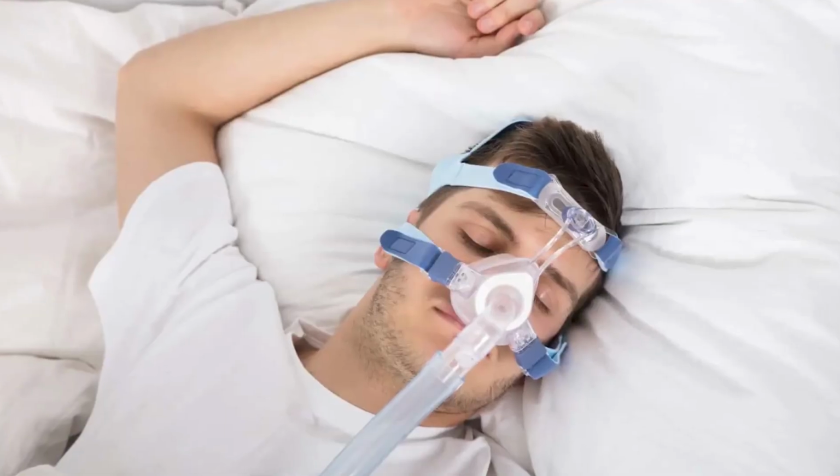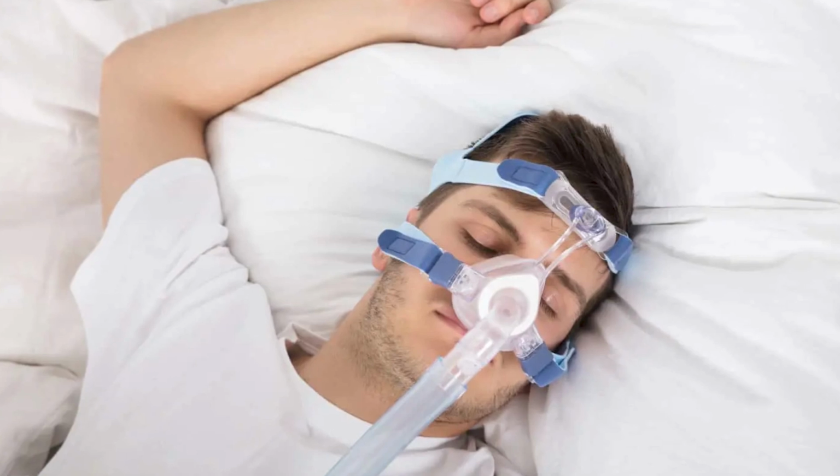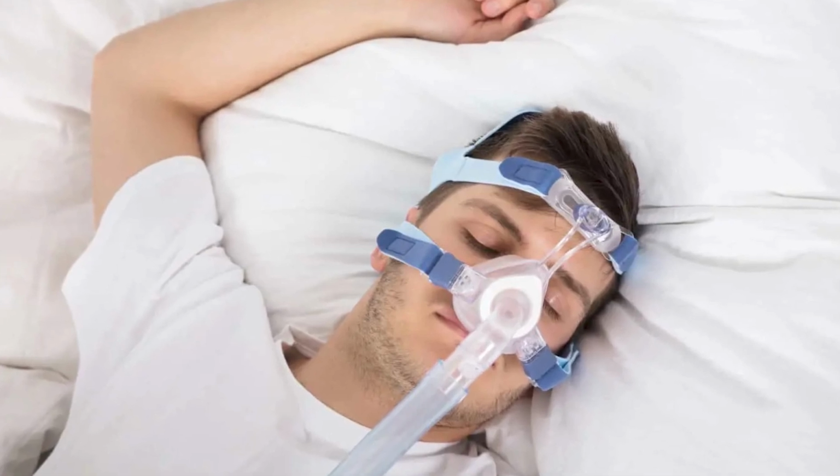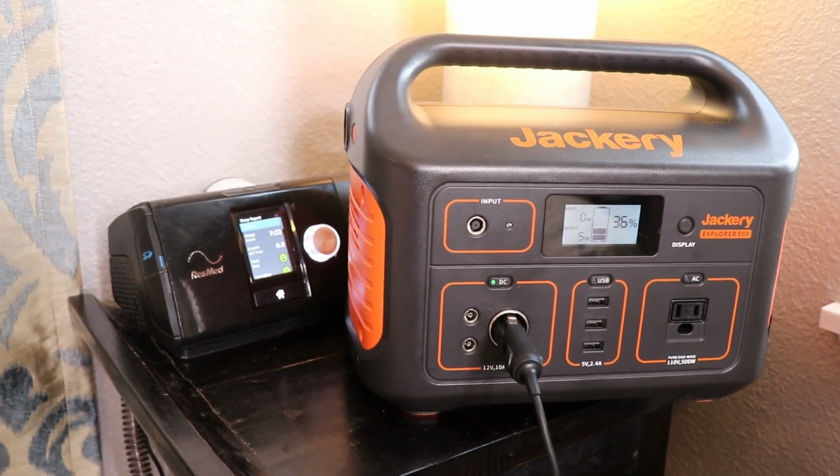Once you get used to sleeping with a CPAP machine, you never want to go back. And so I take the ResMed AirSense 10 CPAP machine with me if I'm going out of town or even camping. Well, what do you do during a power outage? The best thing to do is plug your CPAP machine into a power bank.